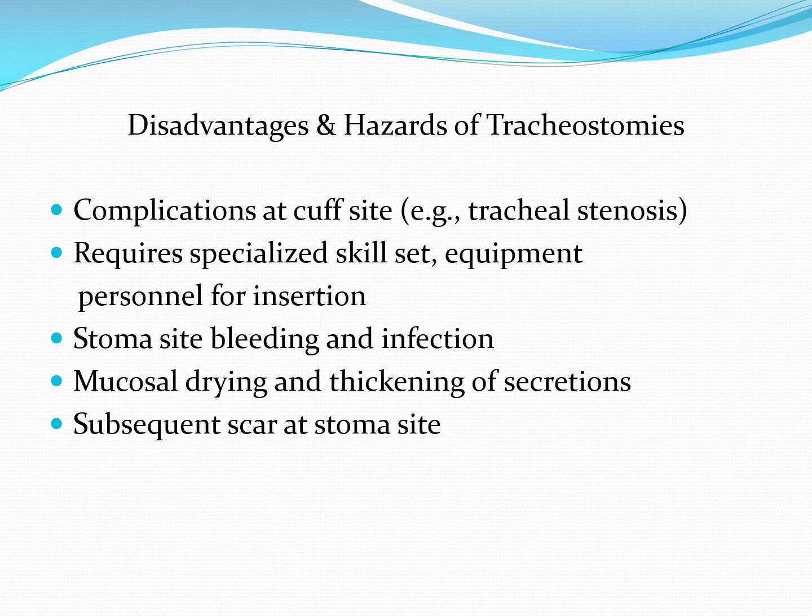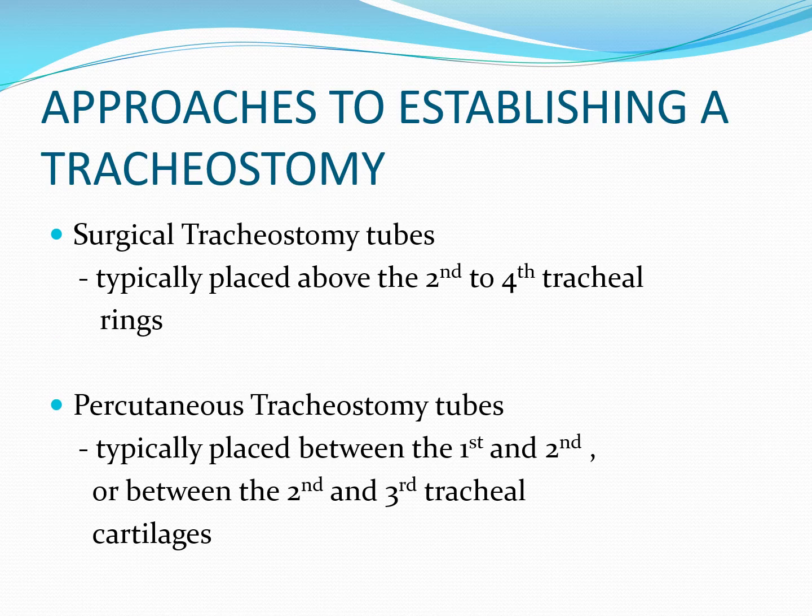Typically they can be surgically addressed to look normal or near normal, but it is certainly a cosmetic issue that's not insignificant. There's two common approaches to establishing a tracheostomy or placing a tracheostomy tube. One of them is much more common than the other, accounting for well over 95% of the tracheostomies that are put in place. It is just a surgical method, where it's either done in an OR or actually done at bedside in the ICU.